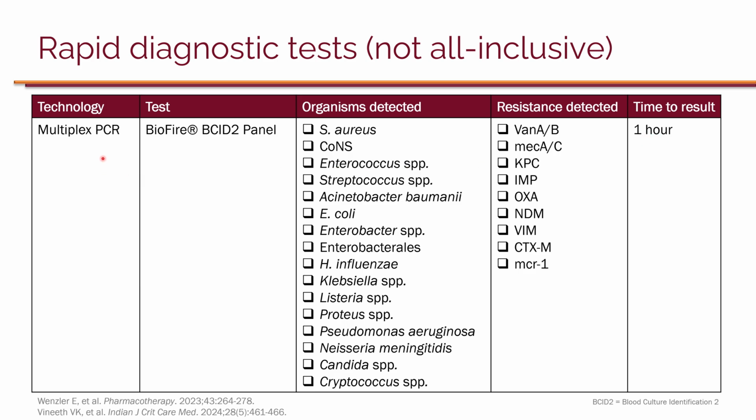Now, the caveat is that it will take some time for organisms to grow in the sample, and once you have a colony formation, then you can put the sample in this test. So it takes some time for those colonies to form. So it's not quite as fast as 1 hour when somebody presents to the emergency department.